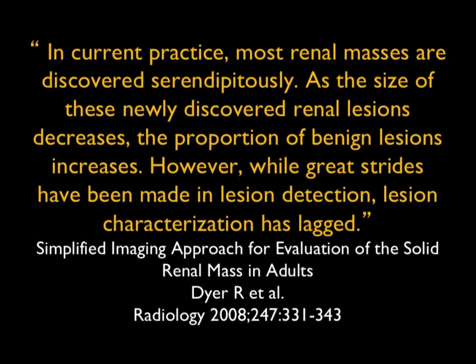Now, as long as I mentioned renal masses and hematuria, let's just make the point that one of the challenges we have, particularly in the ER setting, is we don't have multiple phases typically. And the reality is you sometimes see lesions which appear to be high CT attenuation, but they're not tumors, they're high-density renal cysts. And so characterization becomes critical. So when possible, you may need to have multiple phase acquisition or bring the patient back to clarify things.